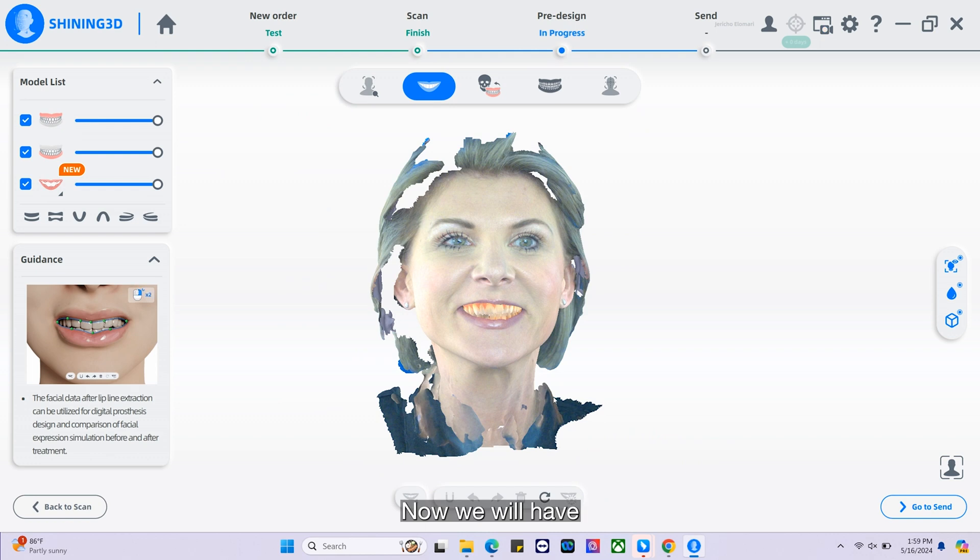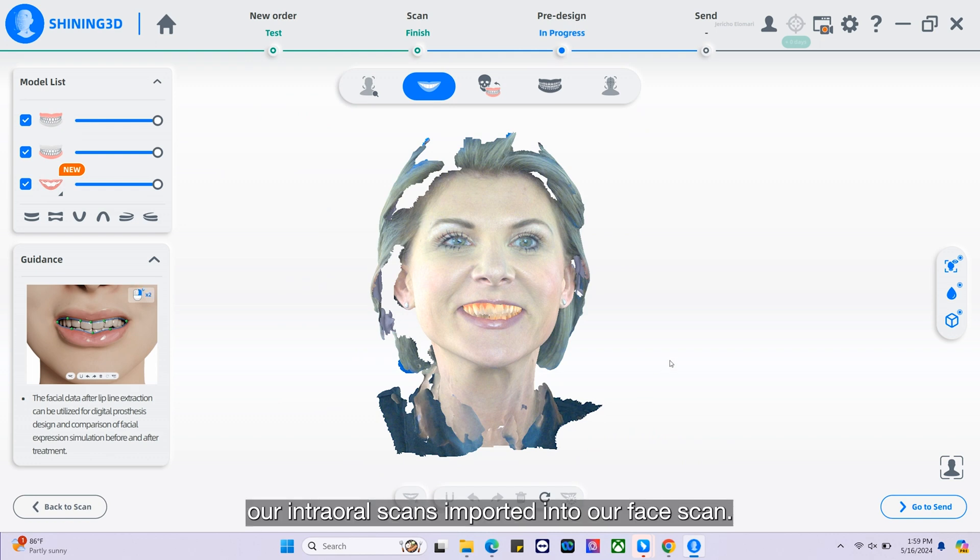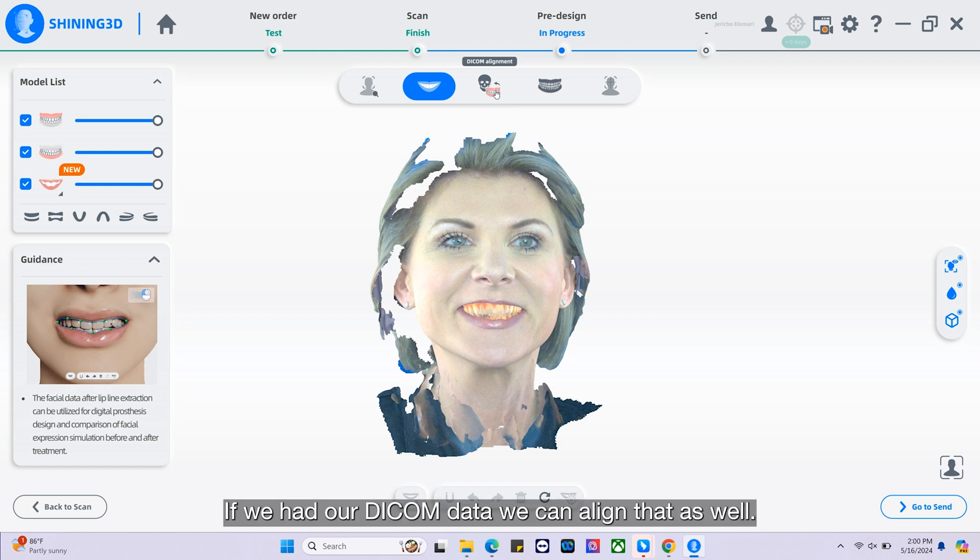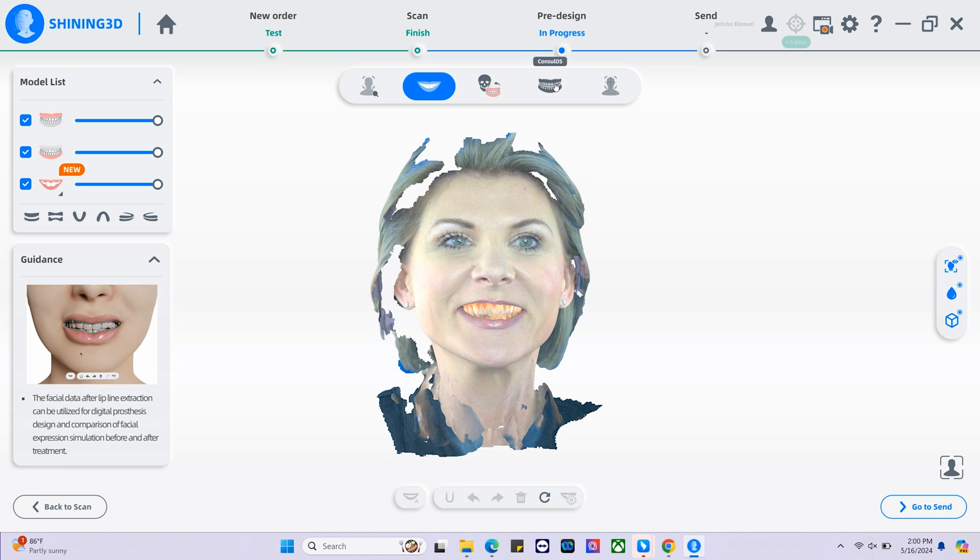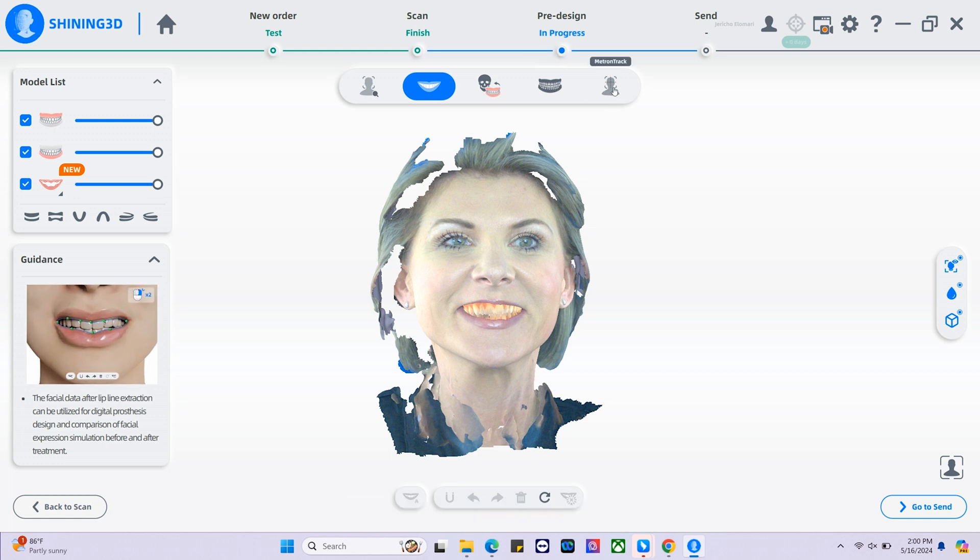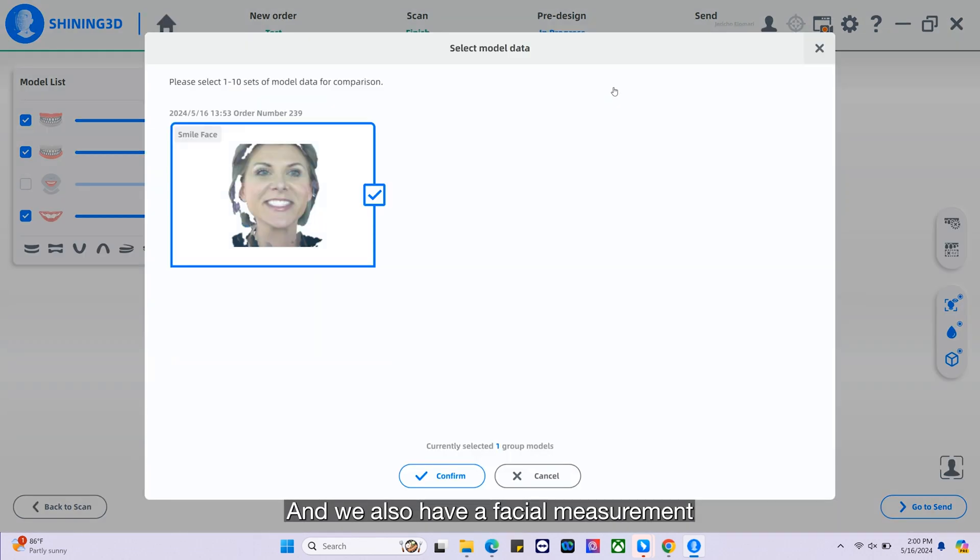Now we will have our intraoral scans imported into our face scan. If we had our DICOM data, we can align that as well. We also have an ortho simulator in our software and a facial measurement report.